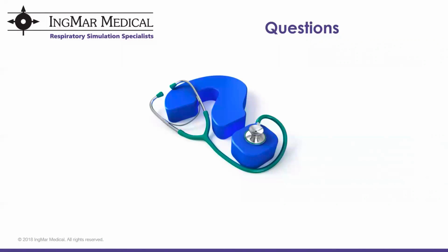So another question we have here is related to calibration of the system. So some of you may be wondering what type of preventive maintenance or calibration is required for the system. Primarily, we are recommending that the ASL 5000 breathing simulator, which is the box which really creates those breathing patterns, we recommend that is calibrated once per year if you're using the system for some sort of research or engineering capacity. But for our educational customers, we recommend calibration to be completed about once every 2 years.